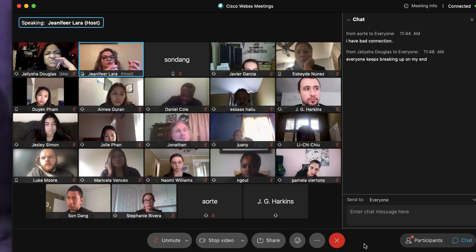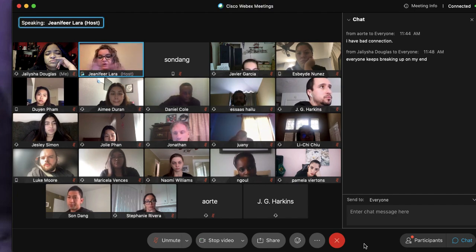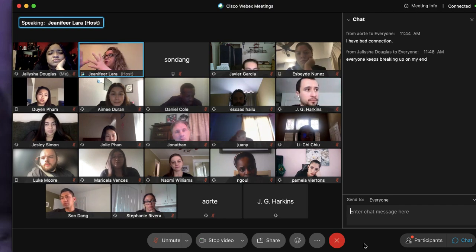In CR, you have an added step. You take the image, you pull out the cassette, you put it into the CR reader, you wait, you hear the sounds of the machine rollers, you know that there's some magic happening, and we're going to explore all that magic, I promise you. Not this chapter, but we will. And then after that, voila, it's on the monitor. Perfect.